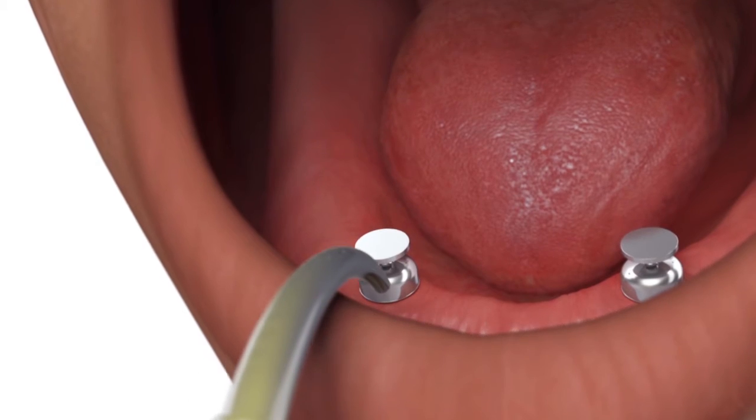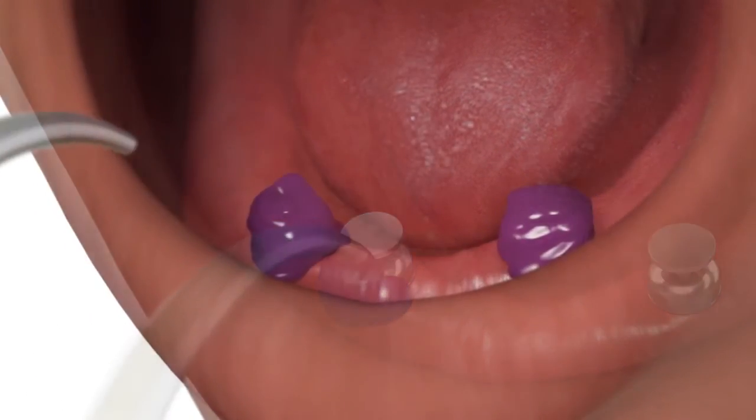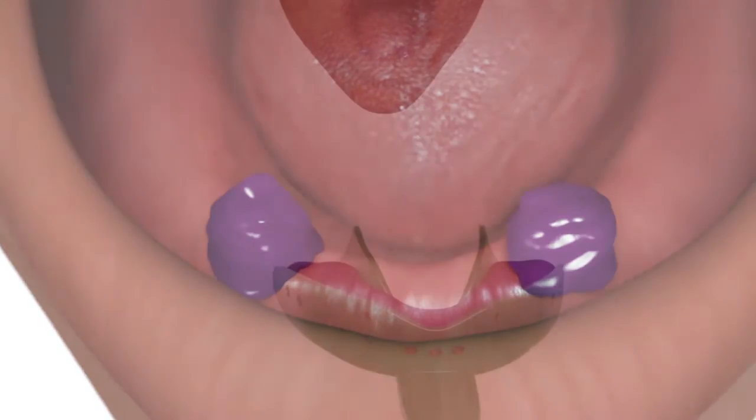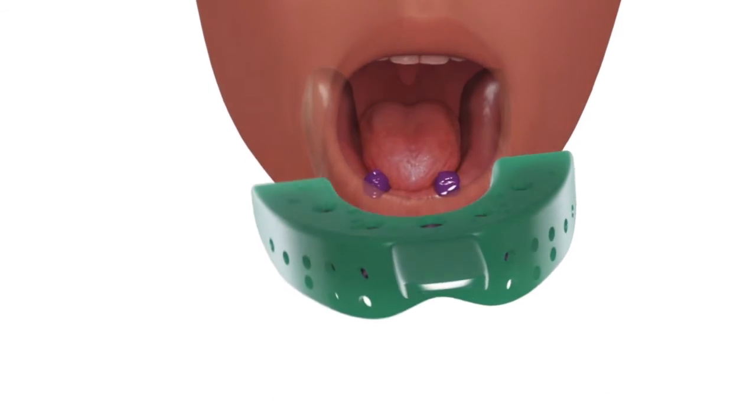Syringe medium or heavy body material around and over the coping body. Load the impression tray with material and make the impression.